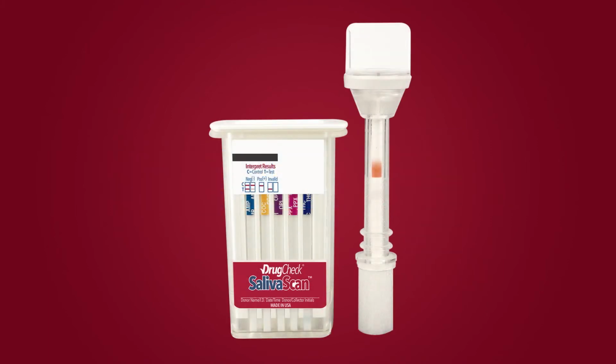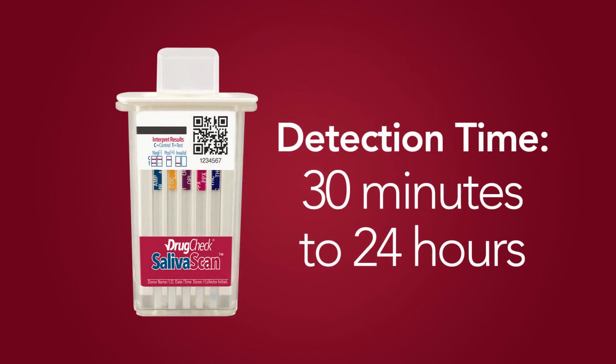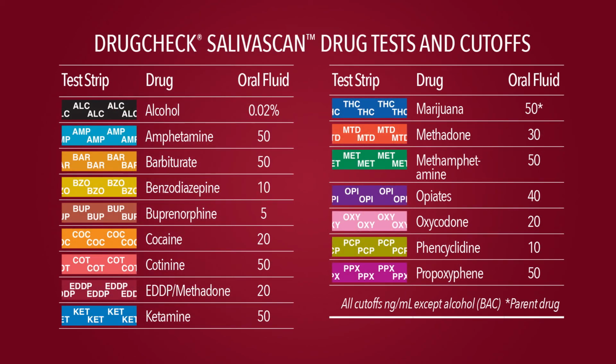The DrugCheck SalivaScan is a presumptive screening test and is not intended to replace an agency's approved evidentiary testing. Oral fluid testing screens for recent drug use and detection times are similar to blood testing, 30 minutes to 24 hours. SalivaScan is made in the USA and can be customized to test for up to 10 of 17 different available drugs.